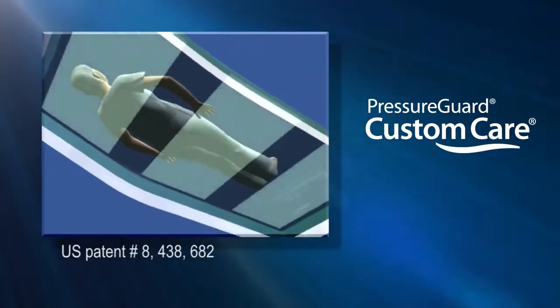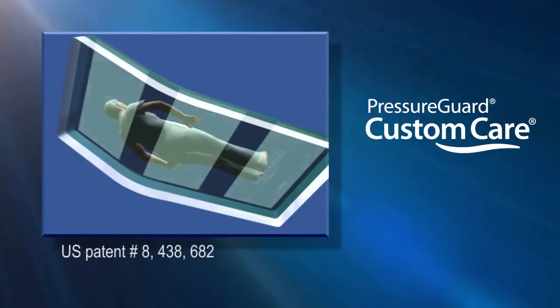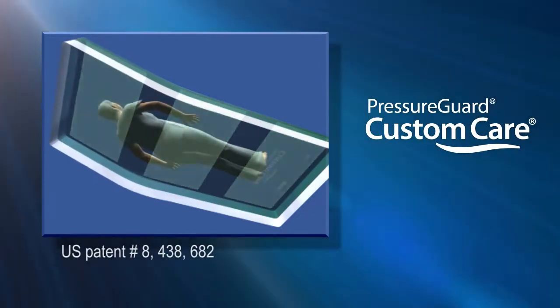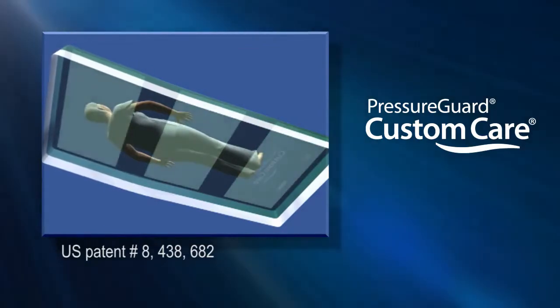This patented design diminishes shear forces by allowing the user to glide smoothly forward during head of bed elevation. And when it's time to return the user to the recumbent position, the shear transfer zones minimize shear by helping glide the user back towards the original position.